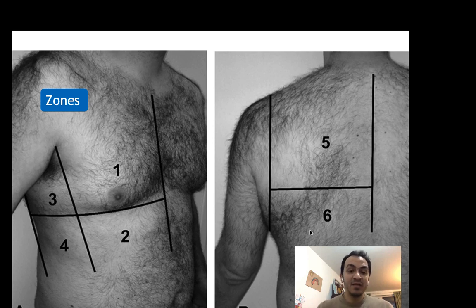It might be a bit challenging in the intensive care to scan the posterior zones because patients usually are supine, but I would always recommend to go as far as you can laterally or try to get to the posterior segments, because this is where the devil is usually hiding.